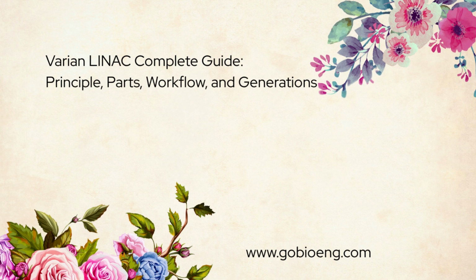patterns. The gantry is the rotating structure that carries the treatment head, allowing beams to enter the patient from different angles. The couch supports and positions the patient, and even small movements matter because radiotherapy depends on accurate alignment. The imaging system verifies patient position, using tools like KV or MV imaging, portal imaging, or cone beam CT. Each component has both an engineering function and a clinical purpose.